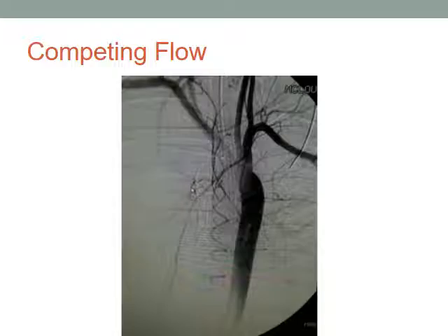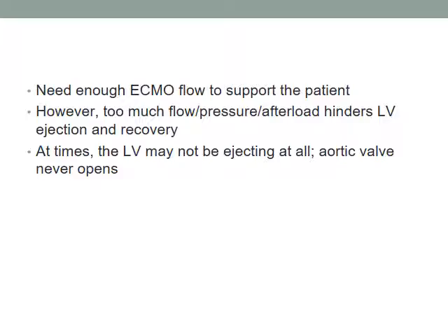And like I said, it changes, sometimes almost beat to beat on these patients. Literally, we've had patients where we look at their echo, and their aortic valve does not open every beat. Maybe it's every second or every third beat the aortic valve goes. So this is a highly dynamic process.